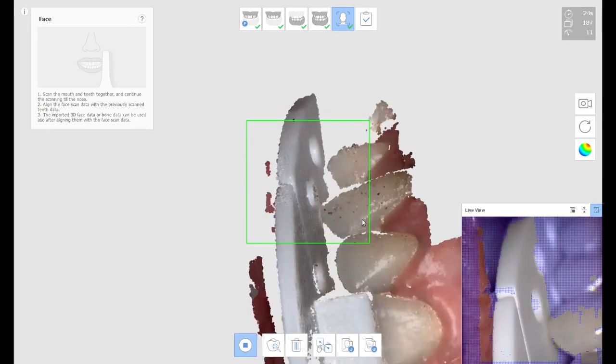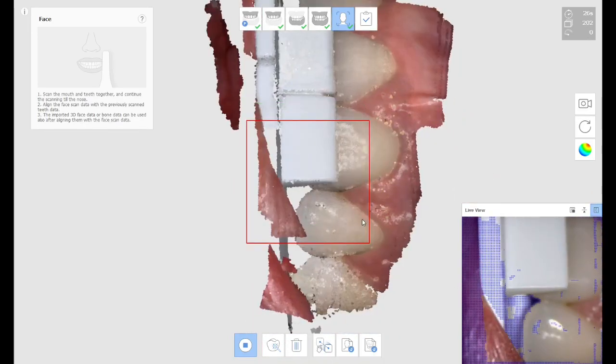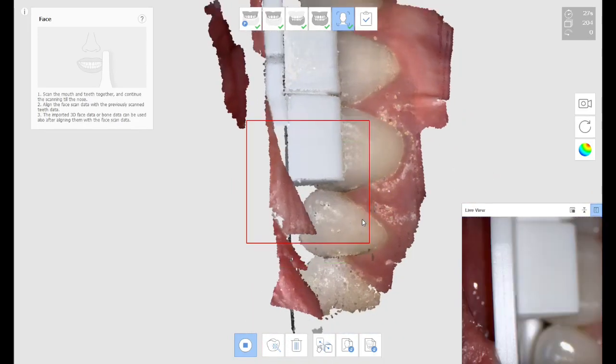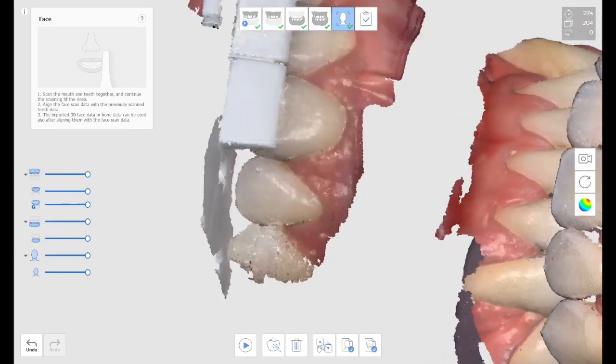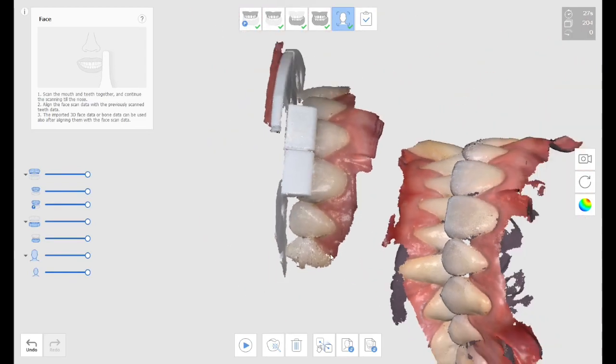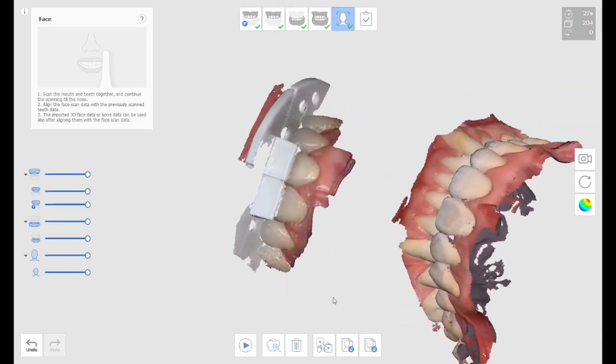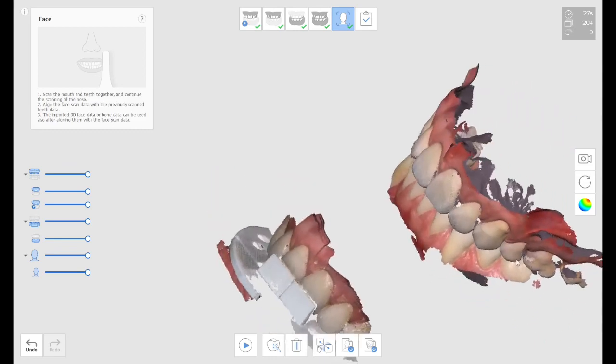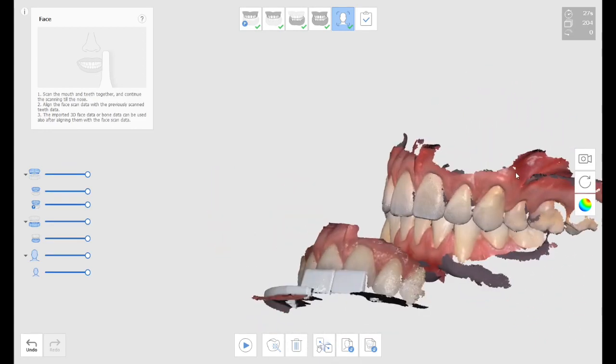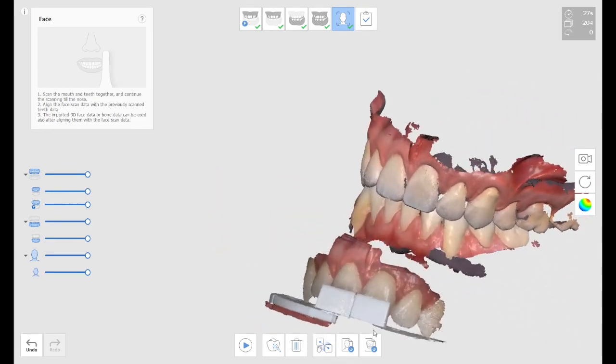So once you scan that as your face scan, then you will be able to align that to the maxilla. So you're going to end up with two files, the maxilla, and then the maxilla with the tray, with the index tray.